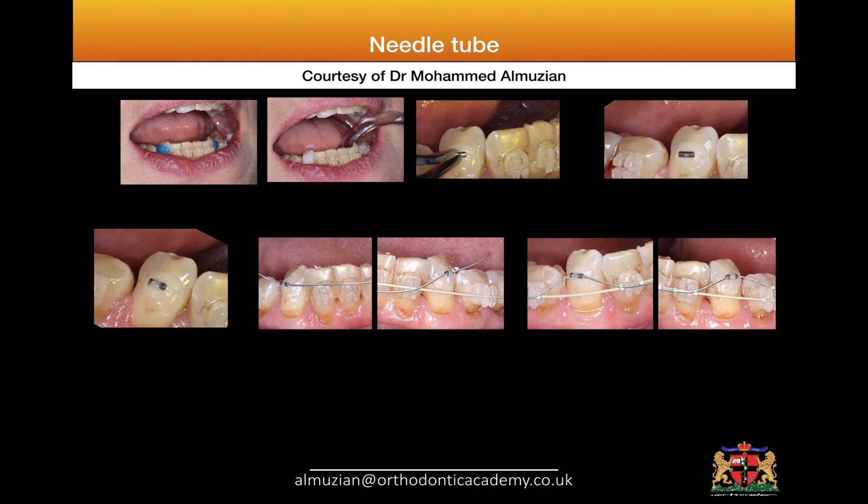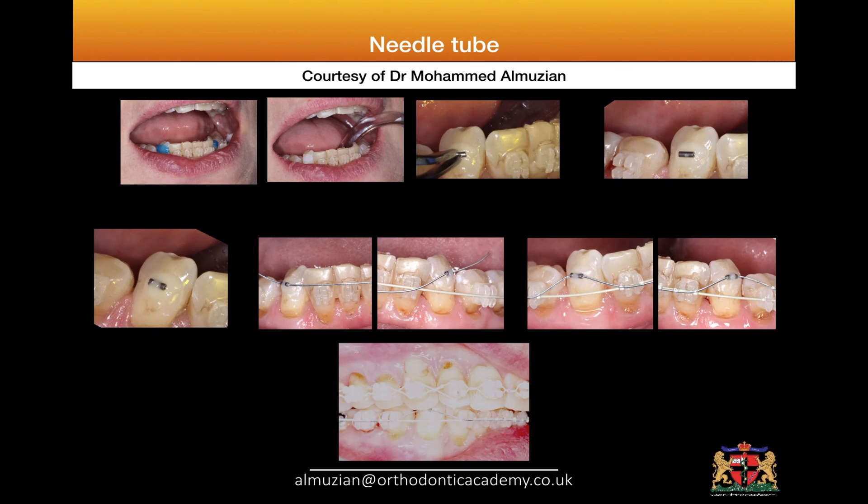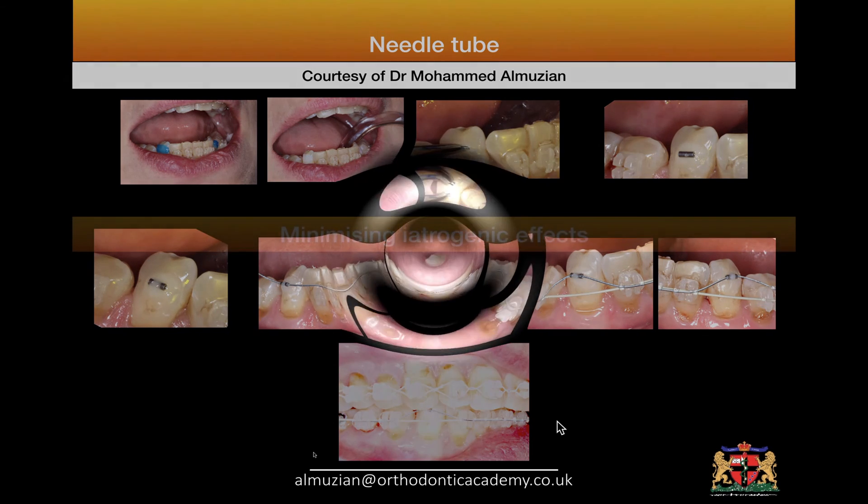I placed it and secured it so it acts as an attachment on the canine — a very low-profile attachment that will not be displaced by the occlusion. As you can see, we have a very deep bite, so if I put any brackets they might detach. There are many other alternatives, such as placing a button on the lingual surface with a slingshot elastic, but this is one of the techniques I consider part of my repertoire. Thank you so much.